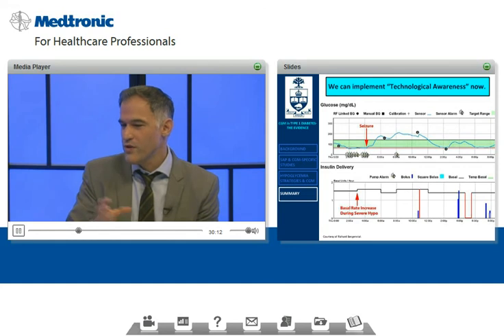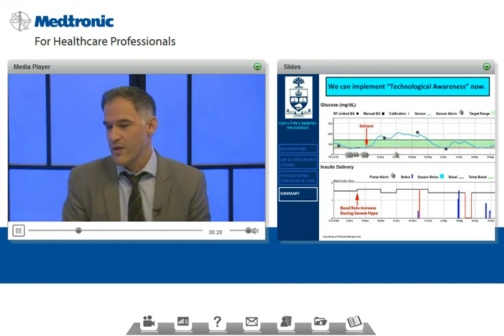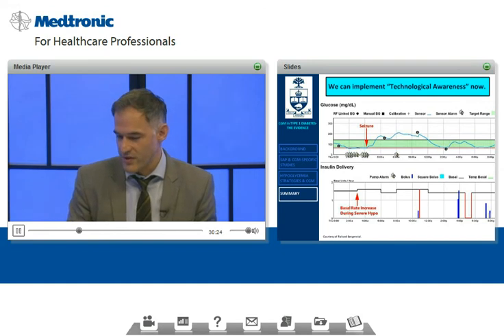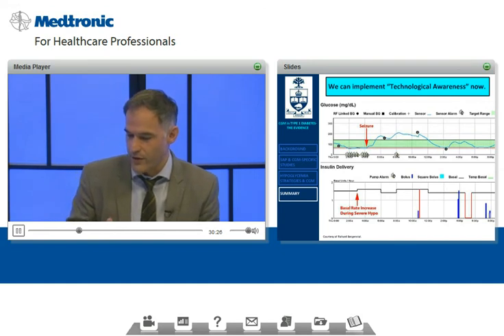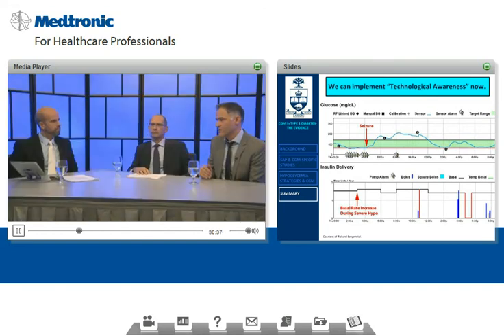And so one reason that people do is adopting this, actually wearing a sensor every night, essentially 24/7, so that they could get the benefit of a low glucose suspend. So my first thing is to say, well, you need to make a commitment to adopting the technology and understand that whenever you manage a piece of equipment, it's not going to be perfectly easy. So you've got to understand that and dedicate yourself to that.